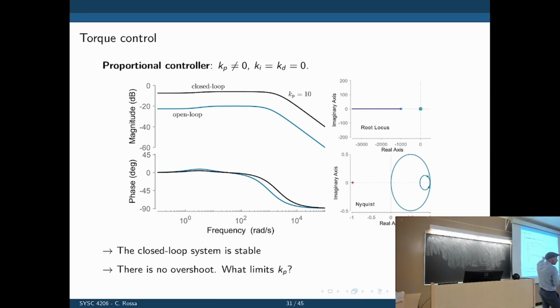And look at the Bode plot of the closed loop system with the controller now. Is it better or worse than before? It's better. Because this is now torque control, so the input is voltage, output is torque. We need a lower voltage in the input to create the same torque. Right? We shifted the gain upwards.